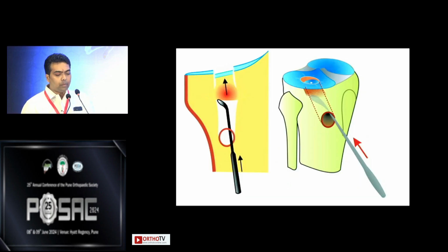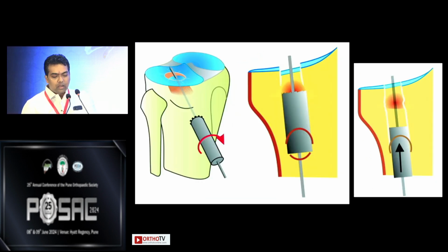Then when we have depressions, as I said, we need to assess the depression arthroscopically and preload the guide wire, usually through the medial side, because these depressions which we treat arthroscopically are usually posterolateral depressions. Therefore, passage of the guide wires from lateral to medial is difficult, so preloading it from the medial side is a good choice. Once we elevate them and look at it arthroscopically, there are different techniques which are described.